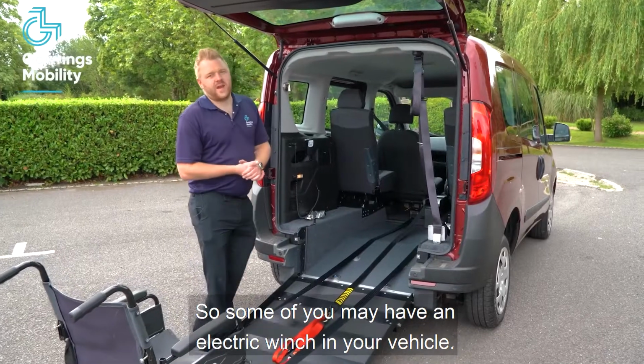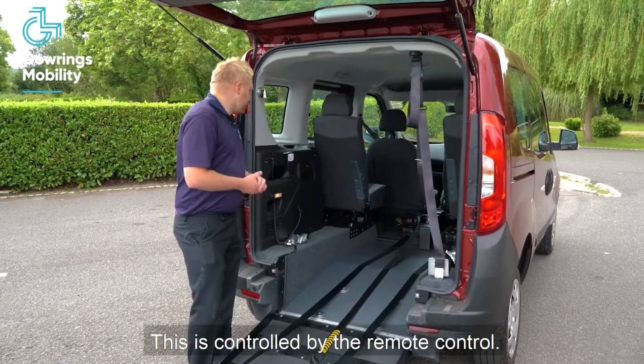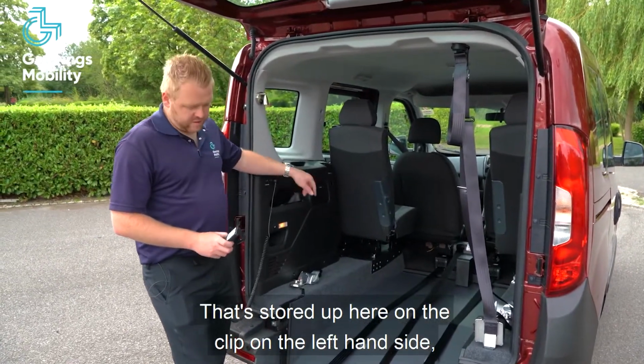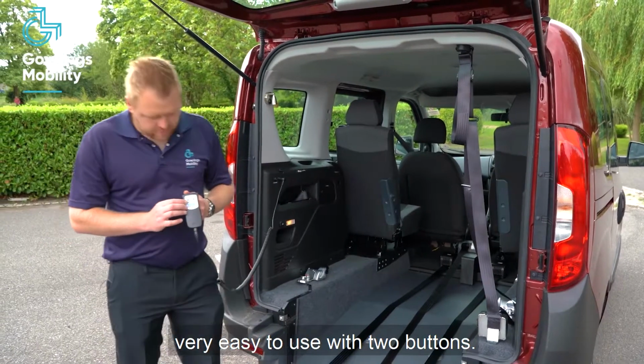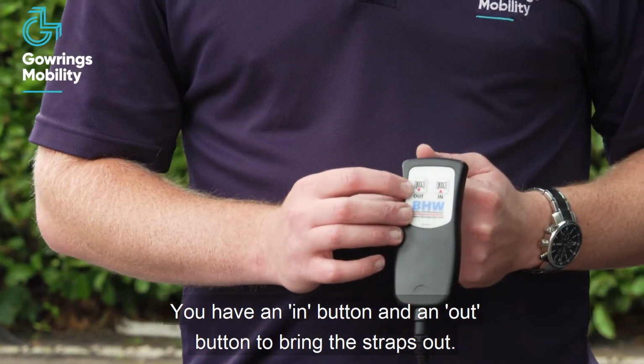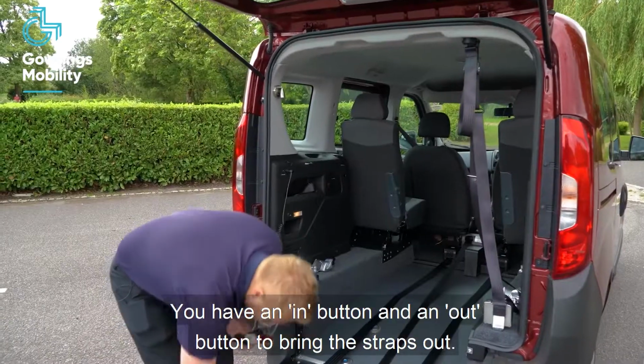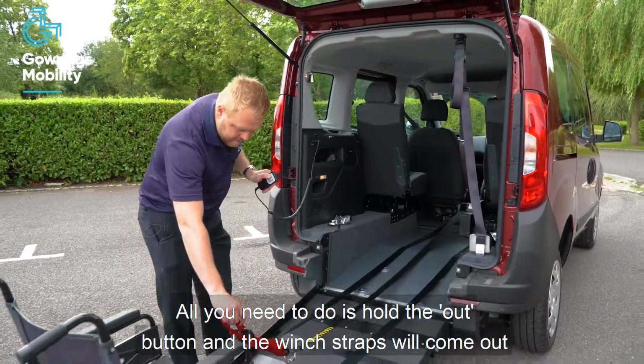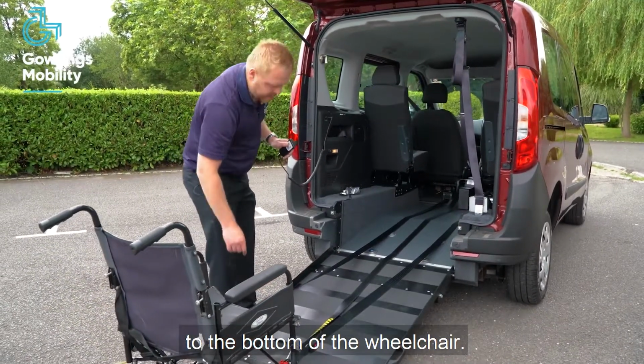So some of you may have an electric winch in your vehicle. This is controlled by the remote control that's stored up here on the clip on the left hand side. Very easy to use with two buttons. You have an in button and an out button. To bring the straps out, all you need to do is hold the out button and the winch straps will come to the bottom of the wheelchair.